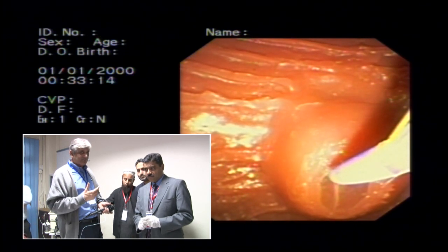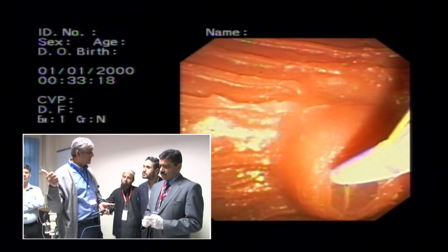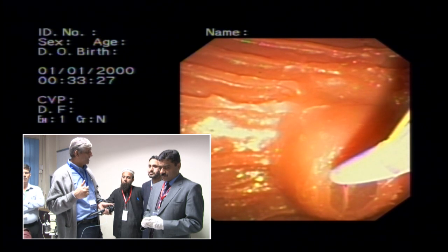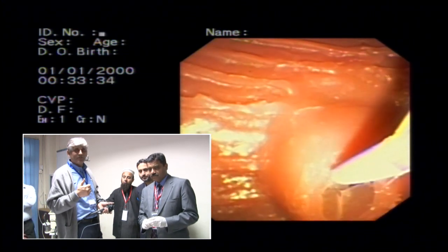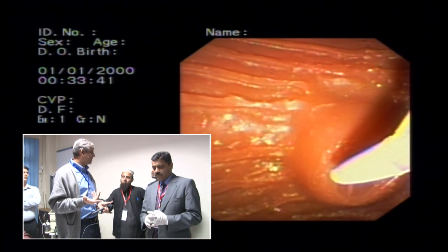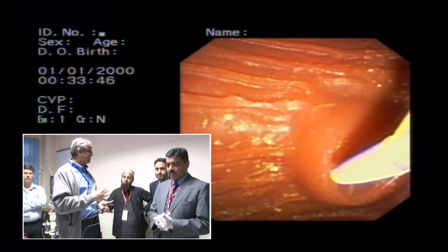with this kind of success, Shahryar and Sajda have done, Shahryar has done over 1,700 cases himself, maybe close to 2,000. I allowed him to do needle knife only 6 months ago. That also under my supervision. So now it gives you an idea. And they were very upset with me because I did around. Today their cannulation rate is very close to my cannulation rate. But now I'm happy because now they've got that concept, they've learned everything.